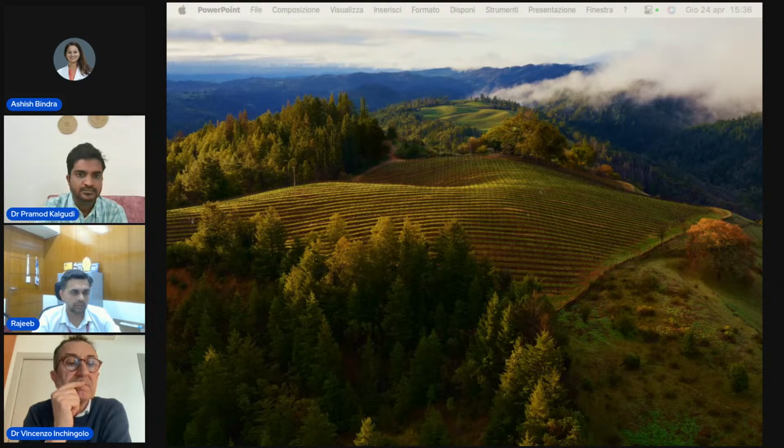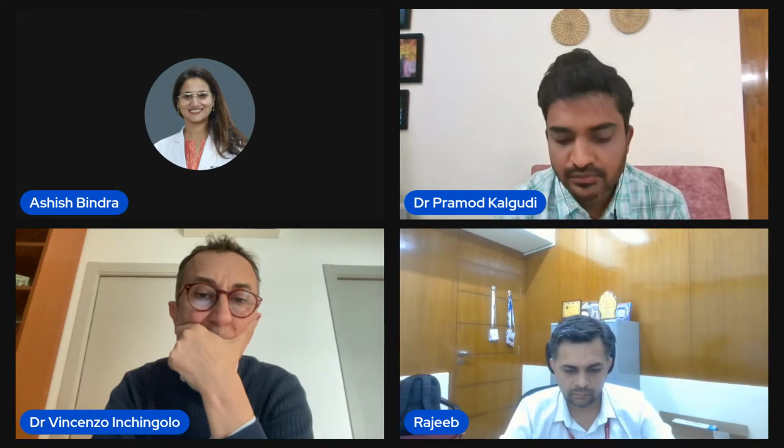Dr. Pramod, you can answer. Unmute yourself. Hello. Am I audible? Yes, you can go ahead. So more often the PI-based formula would give you a value that is overestimating most of the time, and the CPP-based formula has a well-established literature review. If you just take PI into consideration, PI would definitely be a better indicator over RI. But if you're incorporating it in a formula-based technique, I would still go with the CPP-based formula for non-invasive monitoring. And if Enzo can add on to that, if he has any.